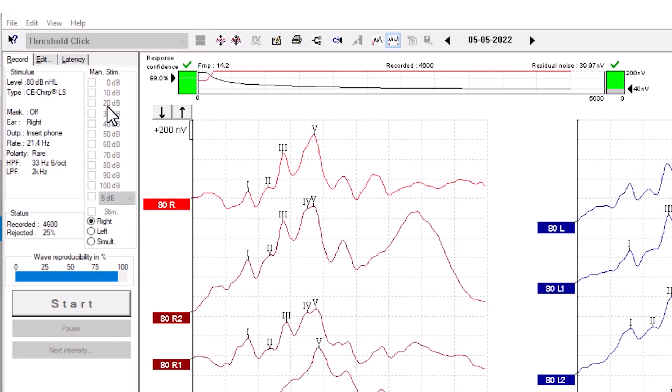Below the intensities, you can choose which ear you want to stimulate: right, left, or both.